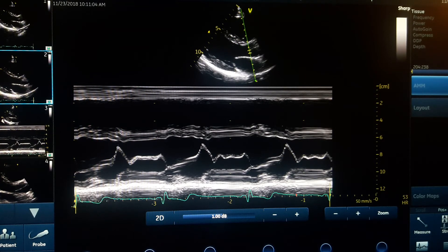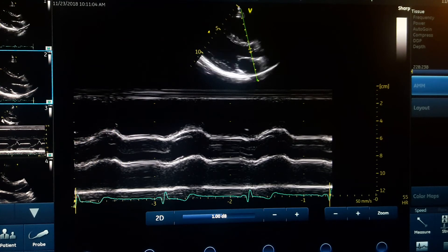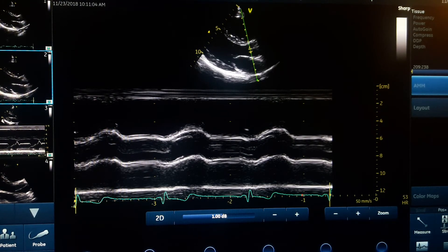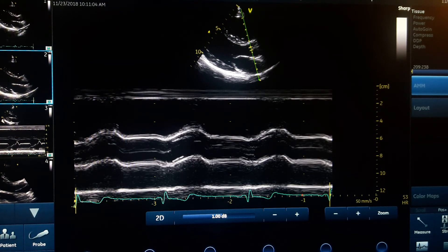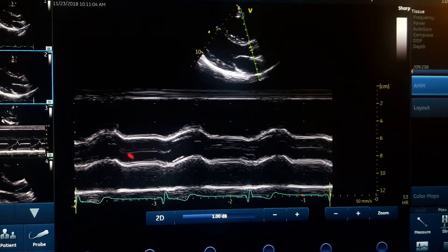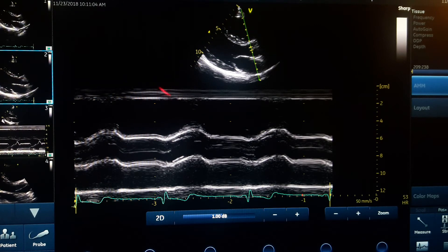Now let's see how the aortic valve M-mode looks. If you correspond the cursor position with the image, you can see: this is the aorta, this is the left atrium, the top one is the RVOT, and above that is subcutaneous tissue, skin, and a little of the right ventricular free wall.